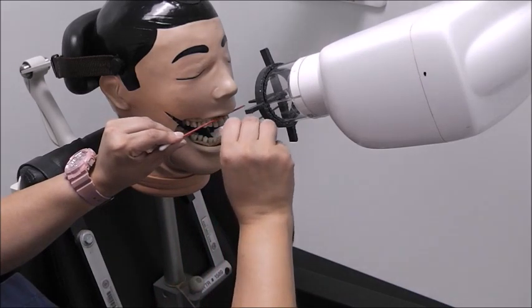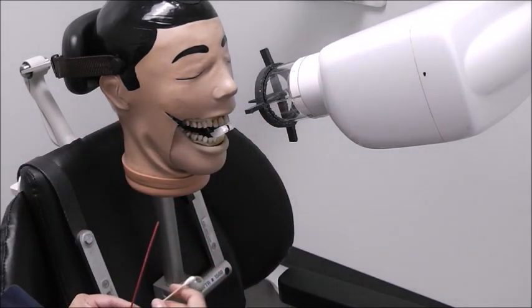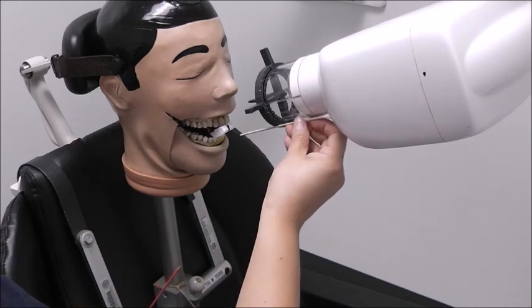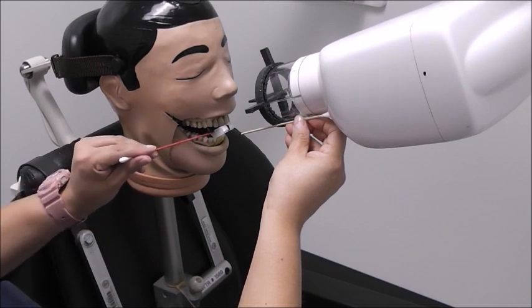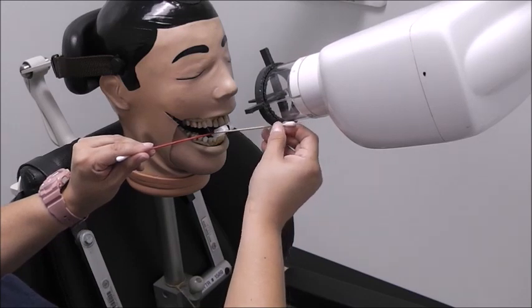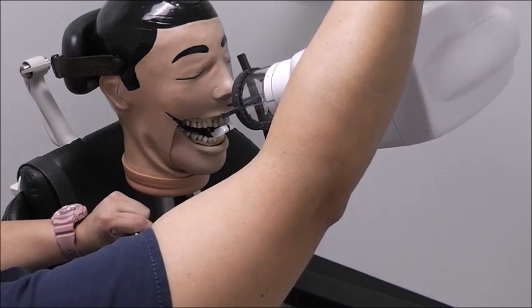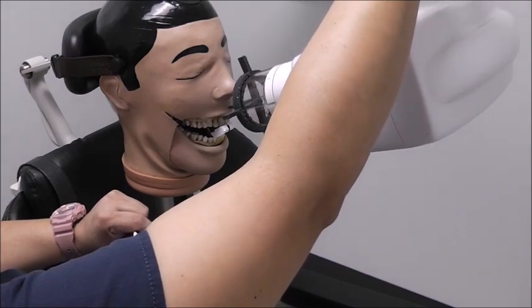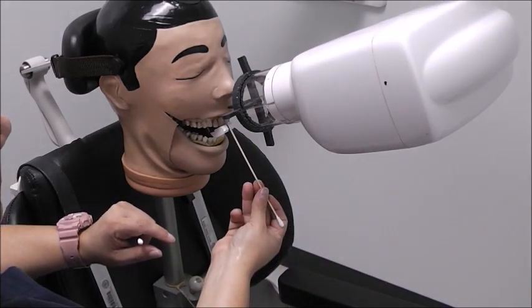We're going to parallel the collimator to our bisecting angle — this is our vertical angle. Then find the horizontal angle: place it against the buccal surface of the teeth to the collimator. Now look at the bottom of the collimator to make sure we cover the plate. Double check that we're covering the plate, then close to the face without touching the patient. Make sure the center of your collimator is in the center of your plate.